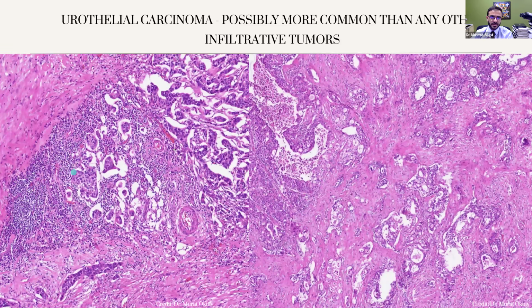If not, it is not a specific tumor stain, because as I told you, NF2 mutations can happen in collecting duct carcinomas. I've only seen one live case of collecting duct carcinoma, and Merlin was retained in our case, but technically speaking, potentially Merlin can be lost in collecting duct carcinomas. Merlin was first identified by our colleague, Dr. Katrina Collins, and again, it's a very helpful marker to document NF2 mutation.